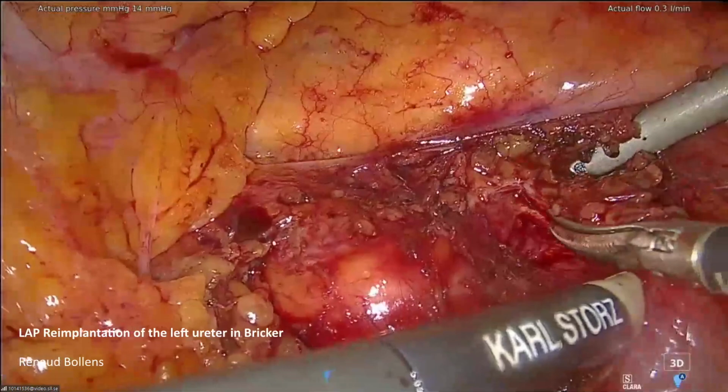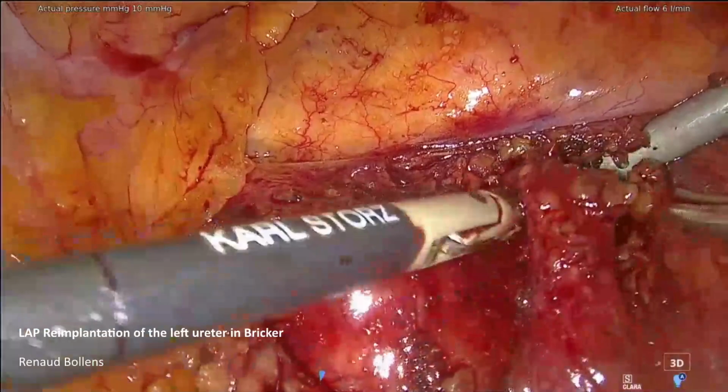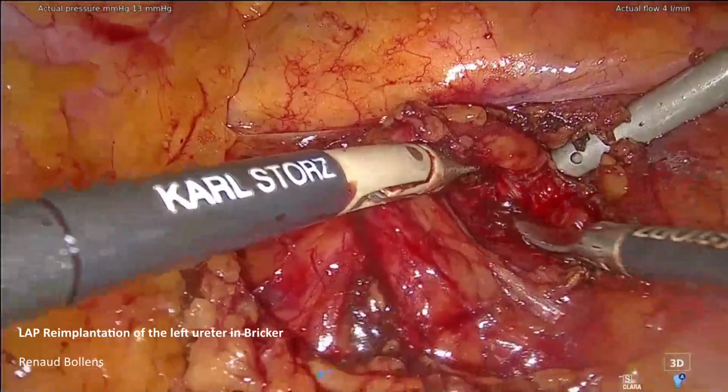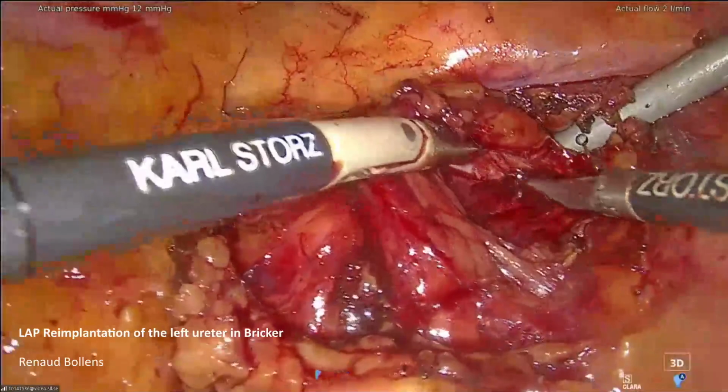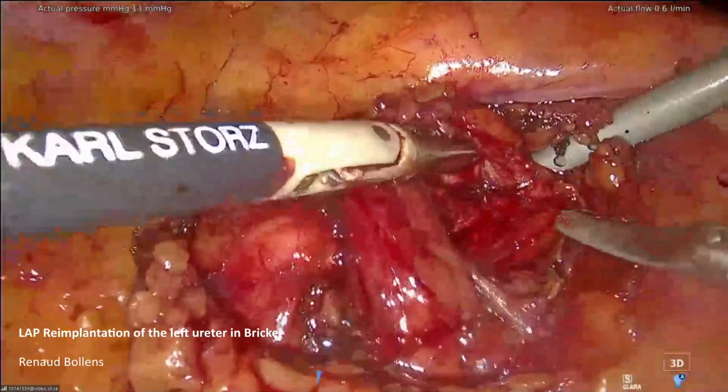Okay, the danger here is with the adherence. I can enter in the wall of the ureter, and then finally I believe that I'm outside the ureter, but I can be also inside. That's the problem. But the length is enough, I think, and I can free a little bit more. Based on the image, the stenosis is probably lower, and I should be still in the healthy part. I will not try to free the distal part, really, because the distal part will be really fibrotic tissue.